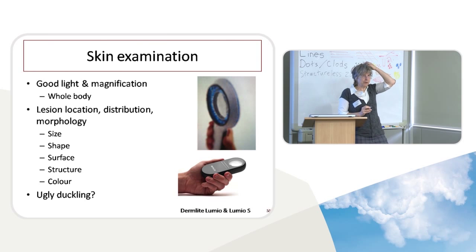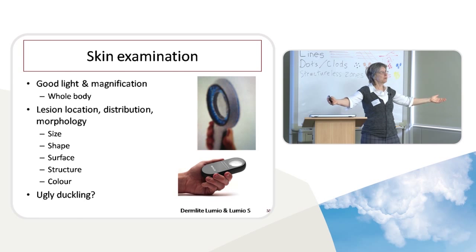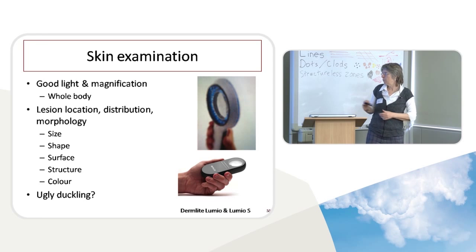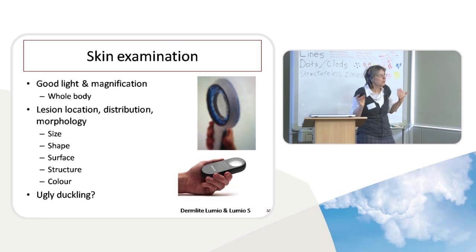So we've got our patient now, and we've taken a history to evaluate their risk of melanoma. And we've taken a good examination of the whole body using a good light. Now, if you have natural light, actually that's quite good for examining the skin. We don't in our clinics anymore, and we have to actually put people on beds to examine their legs because you need light coming from on top. And then I roll them over to see their legs because the light from the top means you're very shadowed otherwise. And again, using the big dermatoscope, we're just getting a general impression of the whole patient.